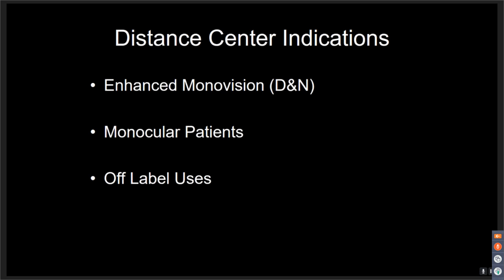Probably for about the last 3 to 3.5 years, we've been trying myopia control with it. If you think about it, what we're doing with the lens is mimicking the shape of the cornea that results from a CRT or orthokeratology lens. We correct the center section for distance, and then we have a ring of power on the outside, which mimics the shape of the cornea. So what I've been doing is, for kids that are progressively myopic and don't want to do orthokeratology, one of the options we offer is an attempt at myopia control with this type of lens.